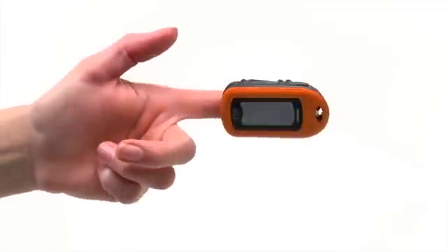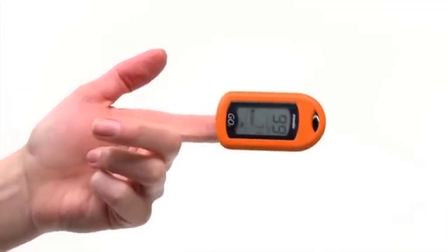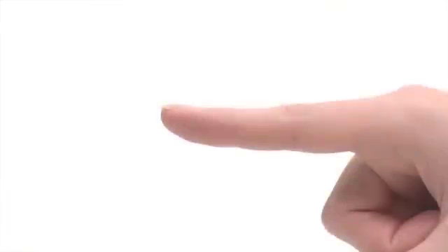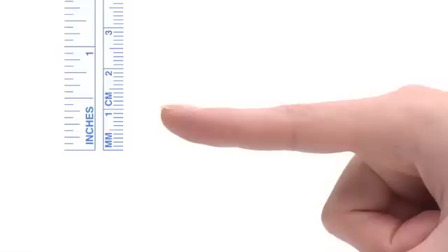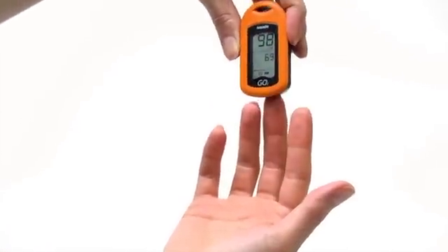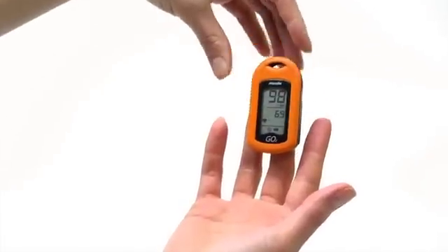The GO II Oximeter is used on the index finger for finger thicknesses between one-third to one-inch thick, or 0.8 and 2.5 centimeters thick, measured from the top of the finger at the middle of the nail to the pad of the finger. The GO II Oximeter may be used on other fingers if directed by your clinician.